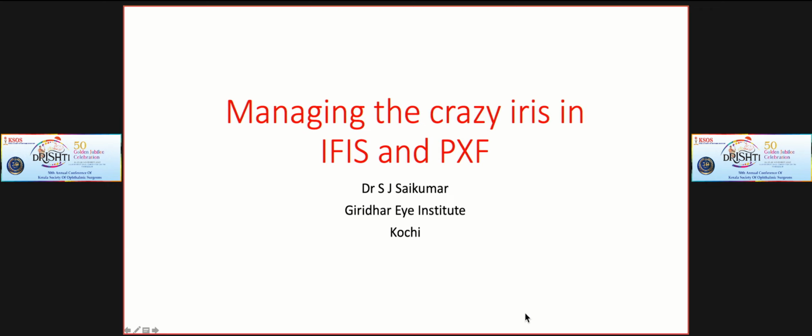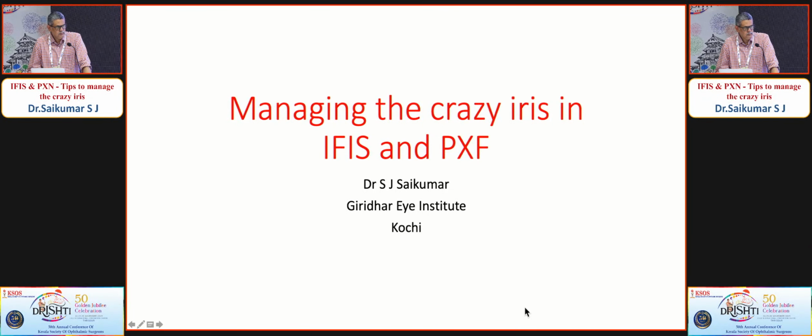You would have seen that I always do a small rexis before I touch the pupil, unless it is really small. If it is about, say, 4 millimeters, I make a 3 mm rexis first. Go with bimanual. I do not use a coaxial. I use a bimanual and go in and aspirate out the cortex. So once that is done, then the capsule goes back.